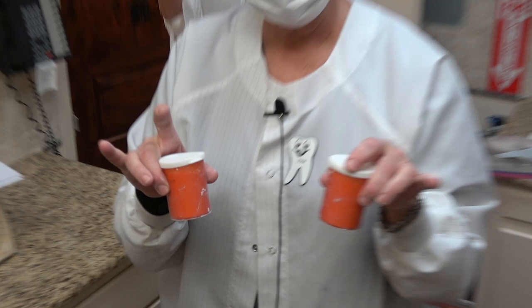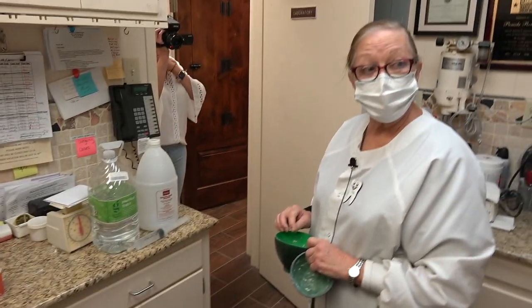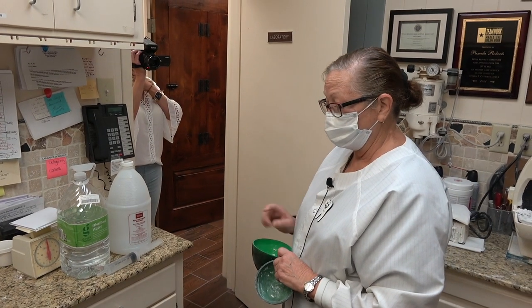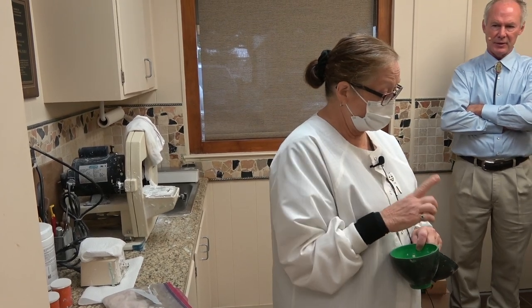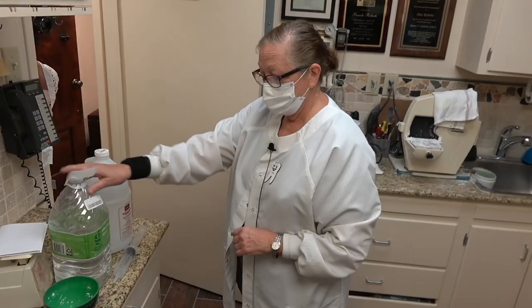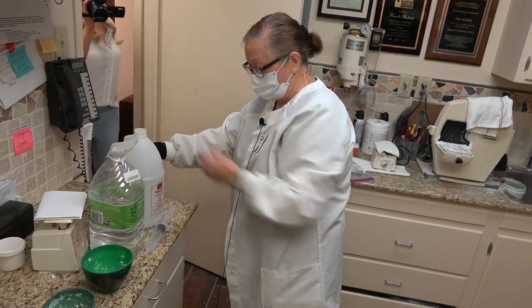Each one of these containers is for an impression, and each stone has its own manufacturing measure. This one is 20 cc's of water — 100 grams of stone to 20 cc's of water. This is Velmix white stone, and then I use Stalite model hardener.